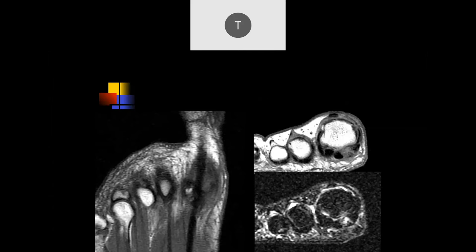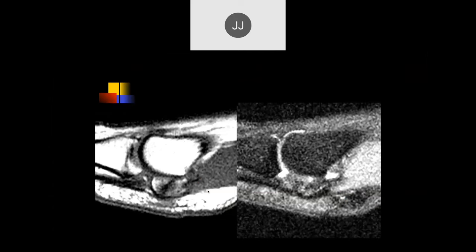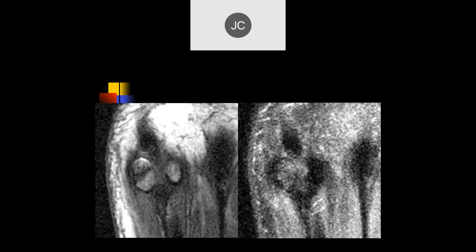This patient has foot pain. Looking at the base of the first MTP joint, there's an injury to the tibial hallucal sesamoid — a sesamoid fracture from running. Here's a more chronic case with injury to the sesamoid as well. Some of these are operated on with tiny screws to put them back together because some will not heal. These sesamoid fractures are not easy to heal.